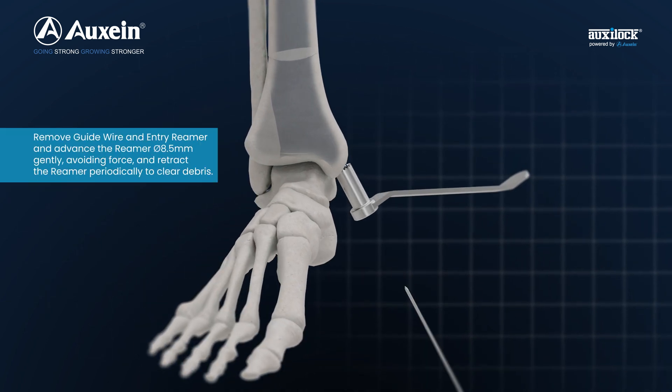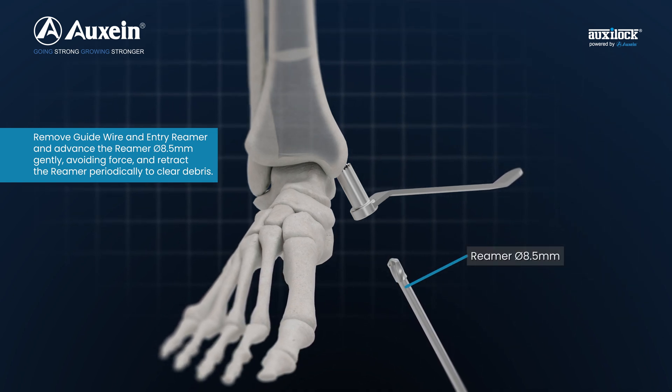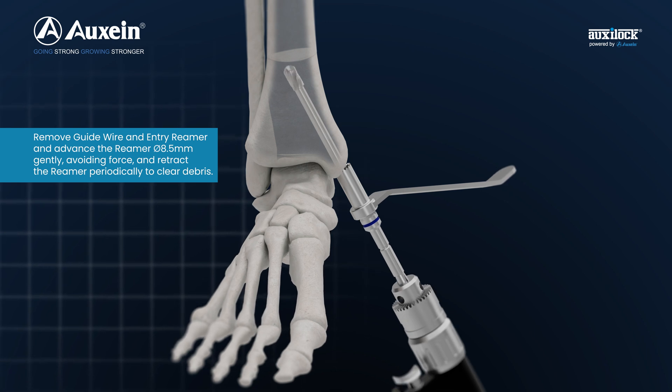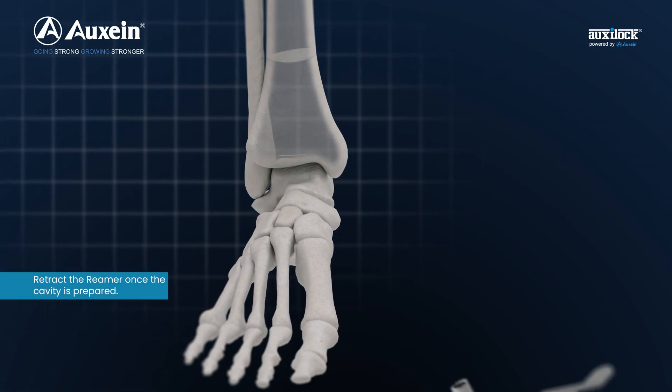Remove guide wire and entry reamer and advance the reamer diameter 8.5 mm gently, avoiding force, and retract the reamer periodically to clear debris. Retract the reamer once the cavity is prepared.